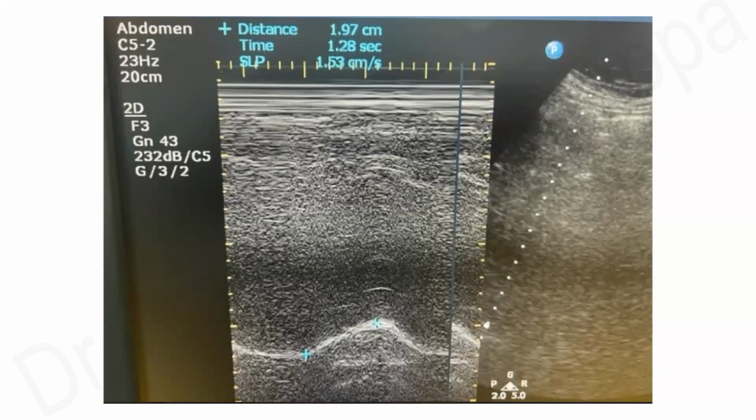It was a successful extubation because initially he had failed an extubation. As you see, the time is 1.28 second on the right side, and that would concur with this successful weaning process. So this is how we would do it. Here you see the time taken from baseline to the peak of inspiratory excursion. So that is the second aspect. We did the diaphragmatic excursion, which should be more than 10 millimeter, and time to peak inspiratory amplitude, which ideally should be more than 1.2 to 1.3, taken as an indicator for good weaning.